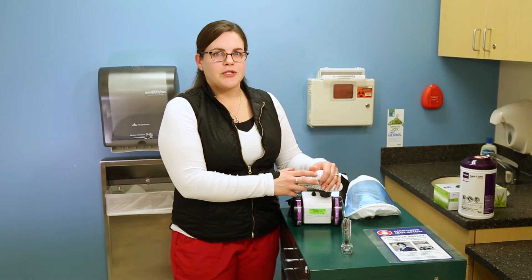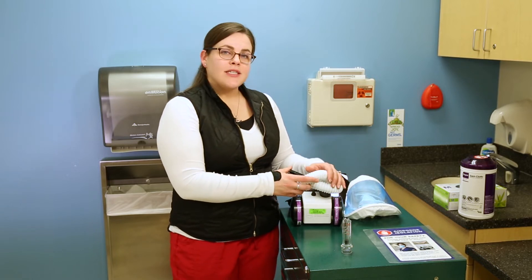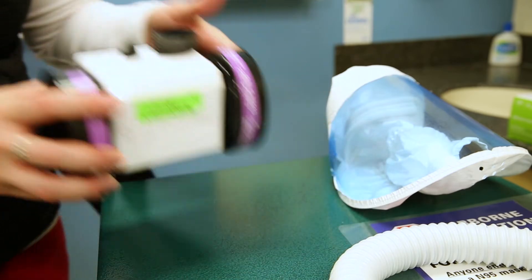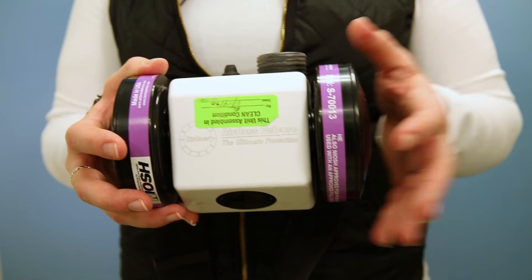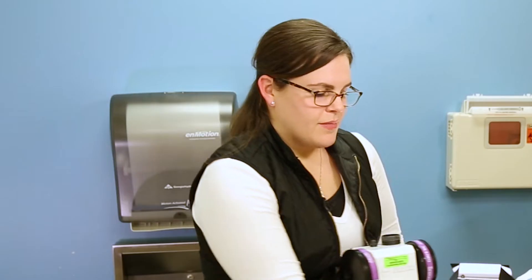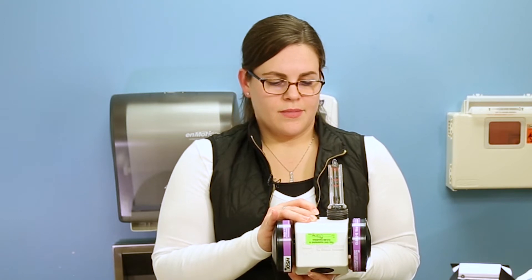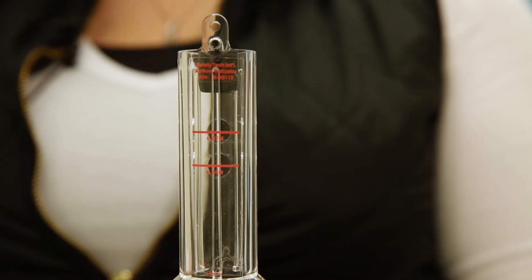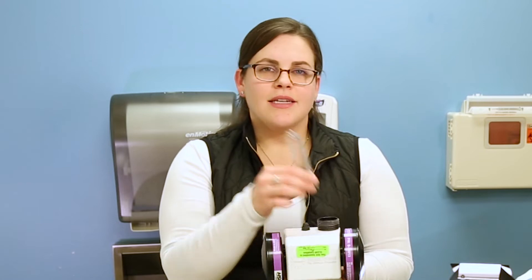Before using your PAPR each time, you should always check to make sure that it's giving you the proper amount of airflow. To test that, you're going to untwist the hose. With your PAPR's blower, you want to make sure that it has a canister on each side, the canisters are not expired, and that it has been cleaned by central supply. Take your airflow indicator, sled it on top where the hose was connected, and turn the machine on. The airflow indicator's bobber will float to the top. You want to make sure that the bobber is floating above the 6 CFM line. If it's not, your machine may not be properly working and it needs to be replaced. Please call Central Supply to have that machine replaced for you. Turn your machine off by pushing the button down, and disconnect the airflow indicator.